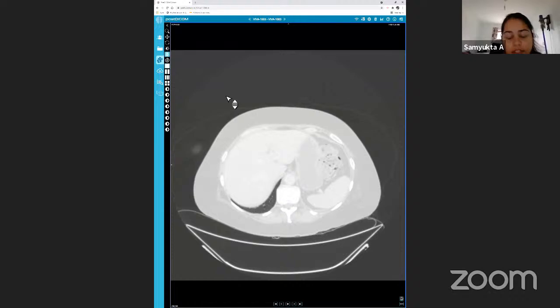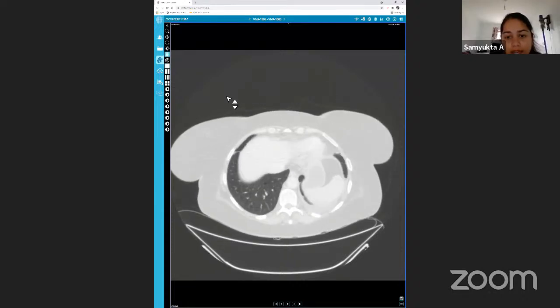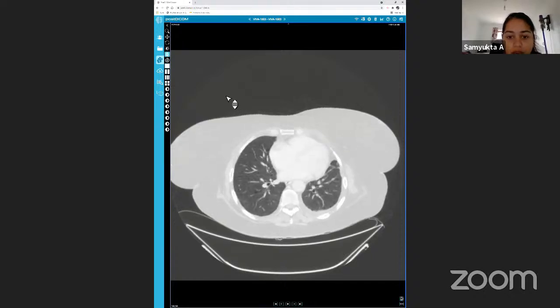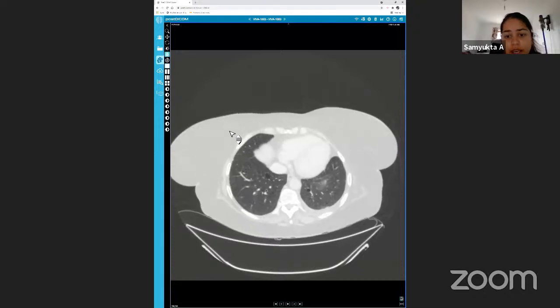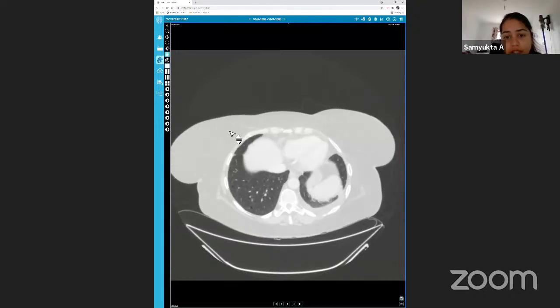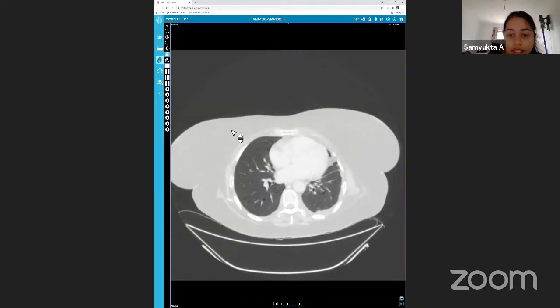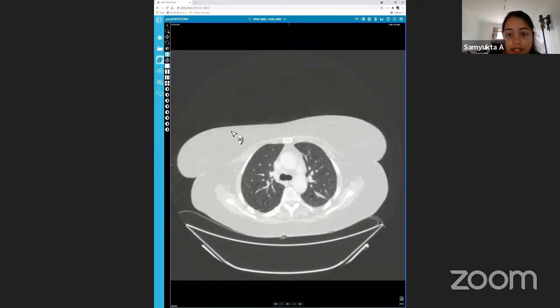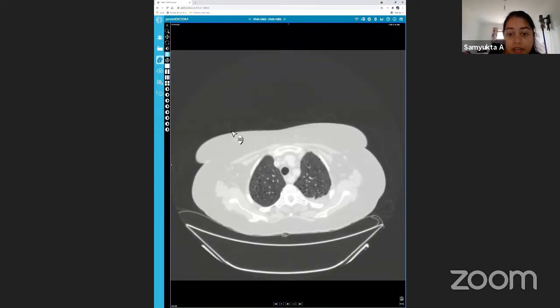This is a young patient, and there's multiple cysts bilaterally, diffusely distributed throughout both lungs. They're of different sizes, but they're quite well defined, and it's a female. And I note that there's a pleural effusion in the base of the left lung. There aren't any nodules that I could see. And they're not sparing the CP angles, and they're involving the apices as well.